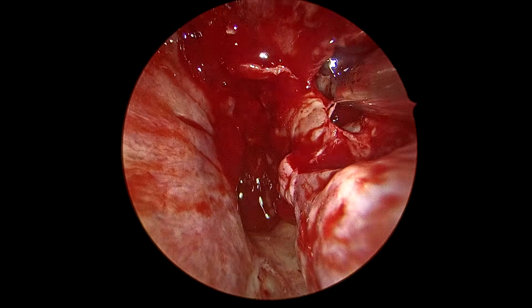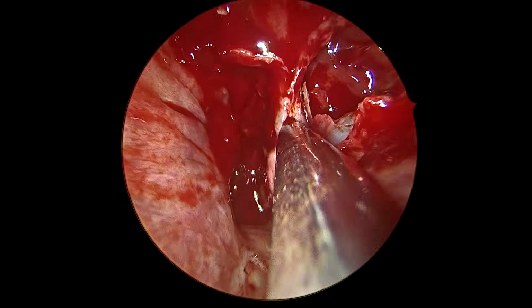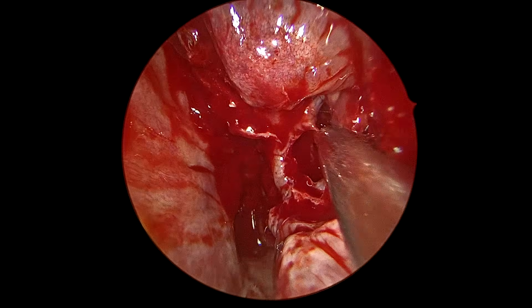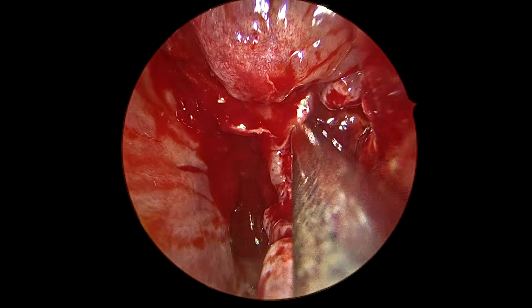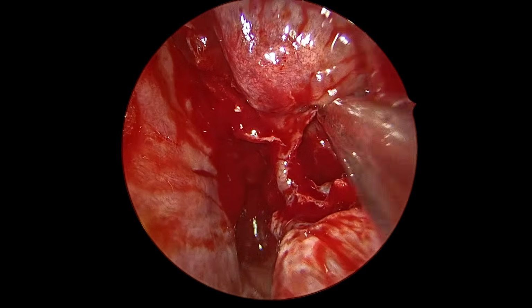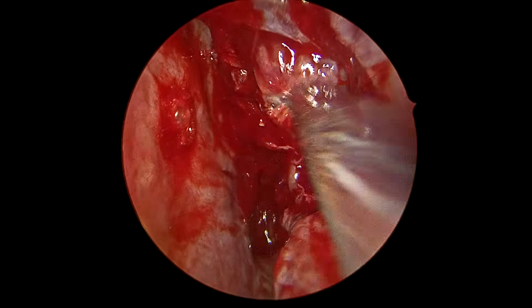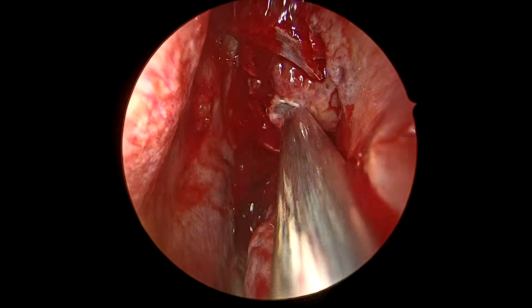Definitely, it doesn't look like a malignancy, so we are safe in that aspect. So this is complete widening of the maxillary sinus. I had removed the middle turbinate because when the mass is suspicious, you should have a clear post-op picture also, and the access should not be limited because of the turbinate, especially the middle turbinate. Resection of the middle turbinate, especially the vertical part, does not cause any problem.